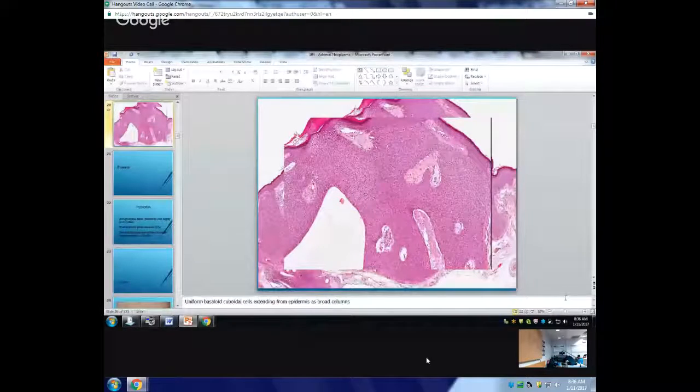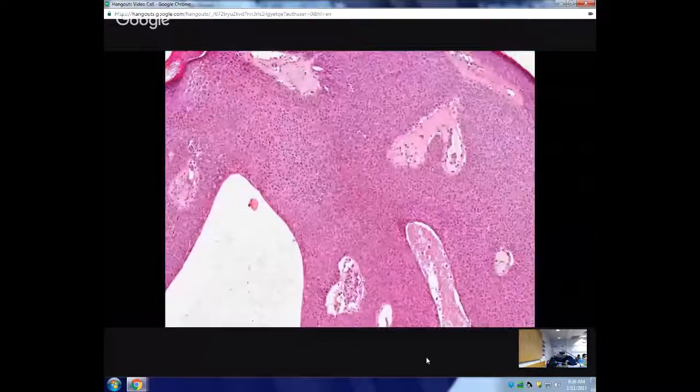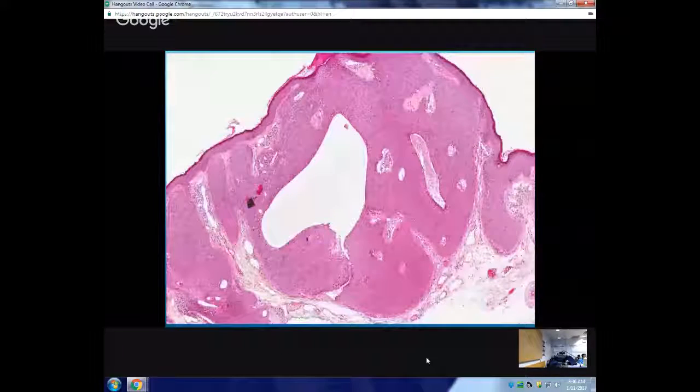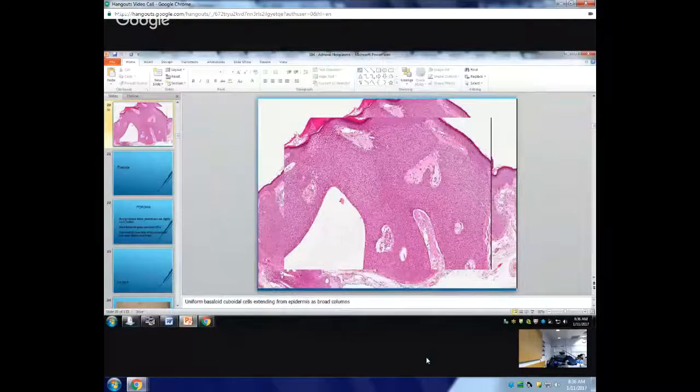So this tumor, the slide that you are showing now, can one confuse it with nodular hidradenoma? The nodular hidradenoma is a very similar entity, but more in the dermis. Let me pull out a slide because right now it's better to show it to you. What kind of stroma did we describe in a poroma?